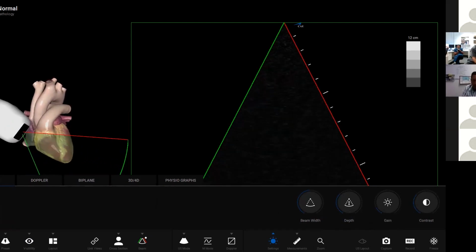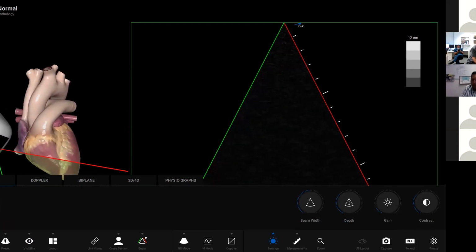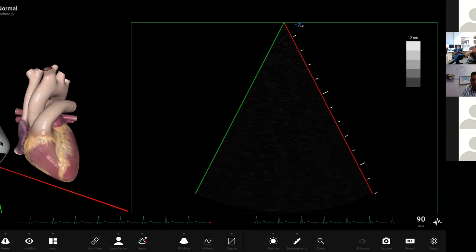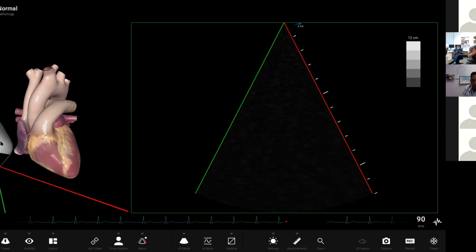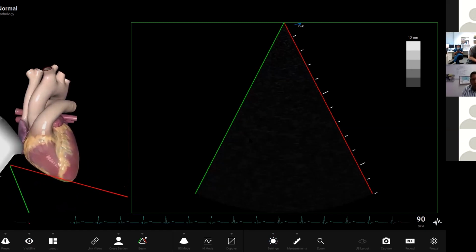It all comes from a single point, but the actual ultrasound beams are coming from everywhere within that section. And so the machine can just phase the timing of the electricity hitting the crystals, to either go a bit more left or a bit more right. And what that does is it just moves the whole ultrasound image looking left or right.